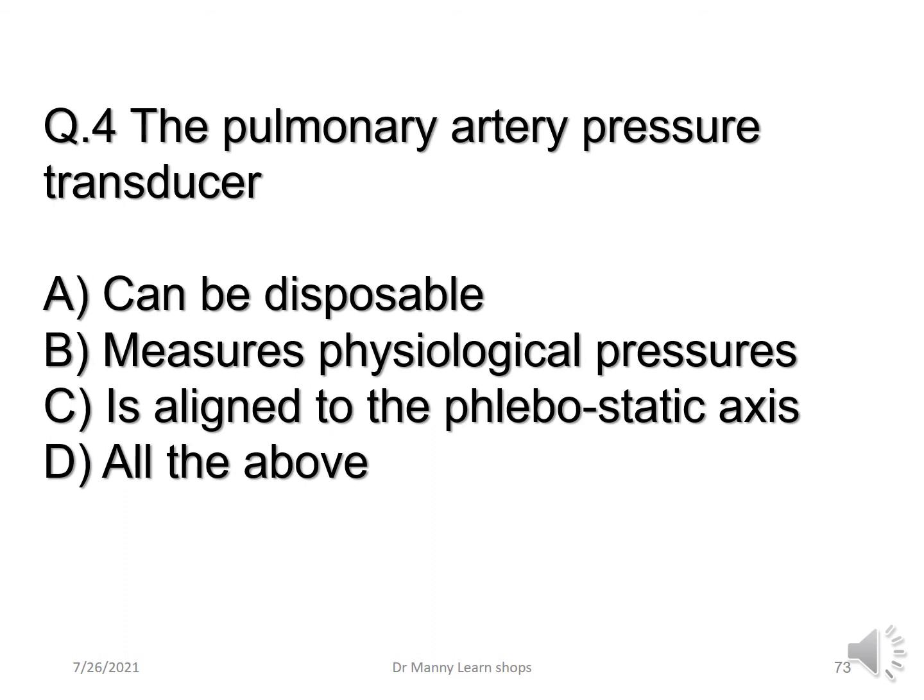The pulmonary artery pressure transducer can be disposable, measures a physiological pressure, is aligned to the phlebostatic axis, or is it all of the above? The correct answer is, it's all of the above.